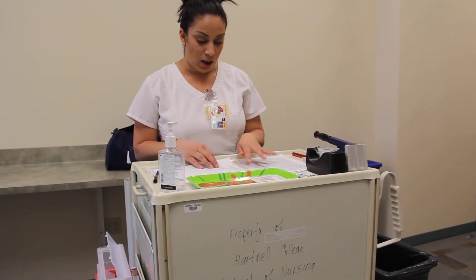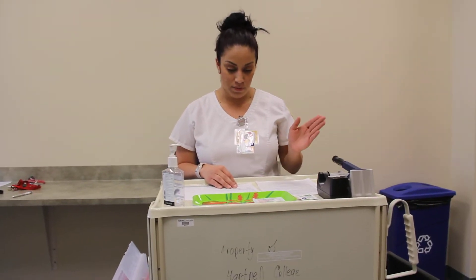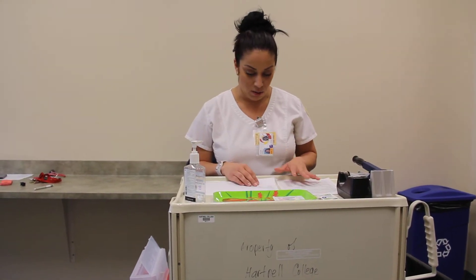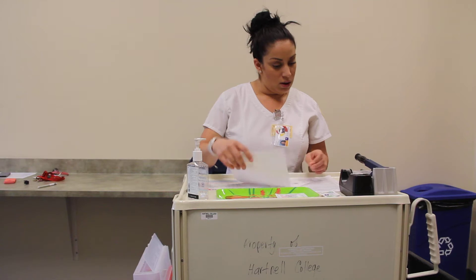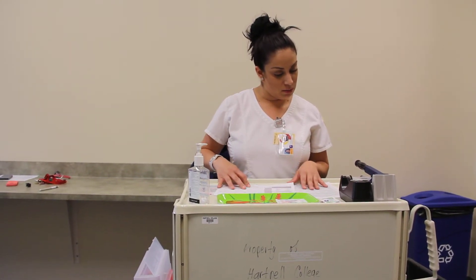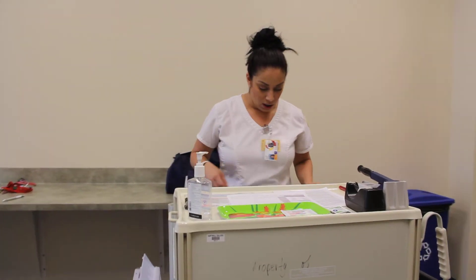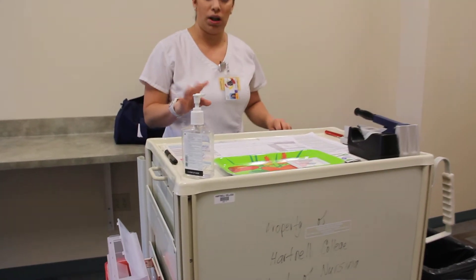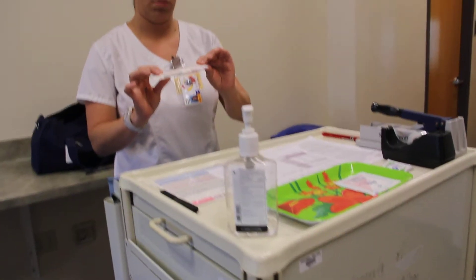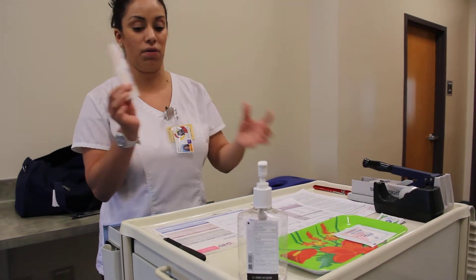My patient doesn't have any allergies, her vitals are all within normal range, and there's nothing prohibiting me from giving her medication. I'm going to open up my medication cart and get my supplies first. I'm going to get my insulin syringe — it's orange. There's only one syringe you can use for insulin. I also have some alcohol.